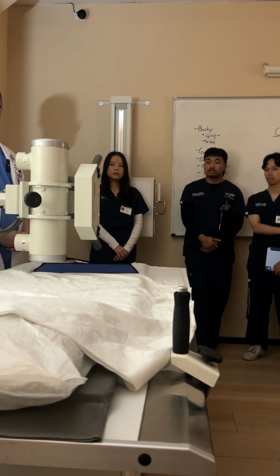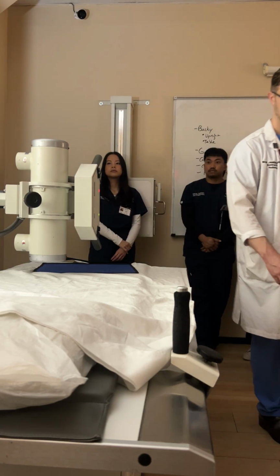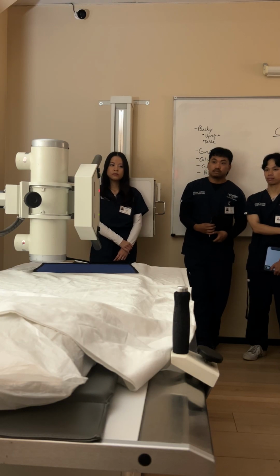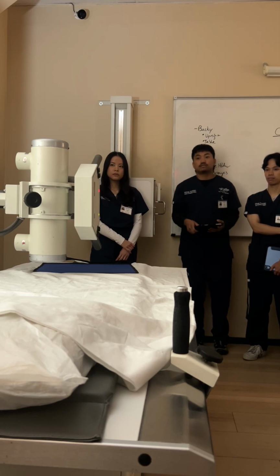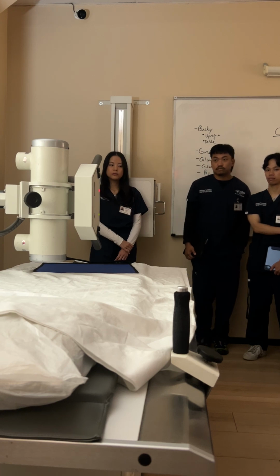You have to warn them about the breathing instructions, because when you're in a lateral, you fix it perfectly, and then you tell them to take a deep breath in, and then they start moving or leaning, that will change your entire position. So you want to let them know, stay in this position, take a deep breath in the exact same position. Don't lean, don't move forward, don't do anything. Just stay in that position.